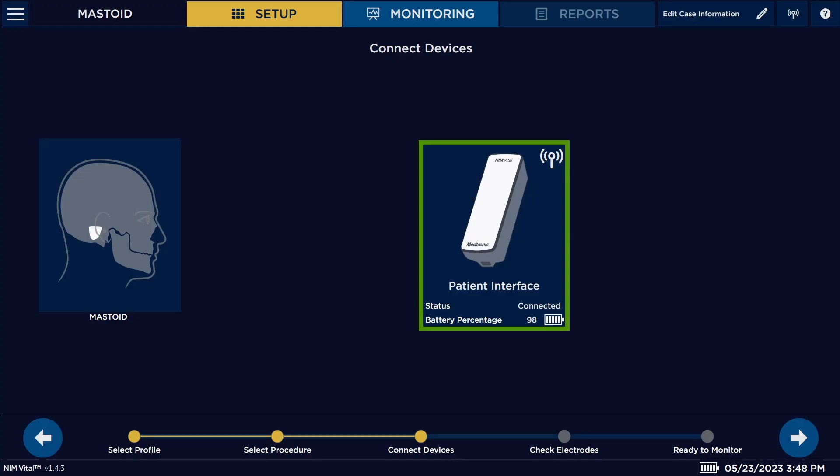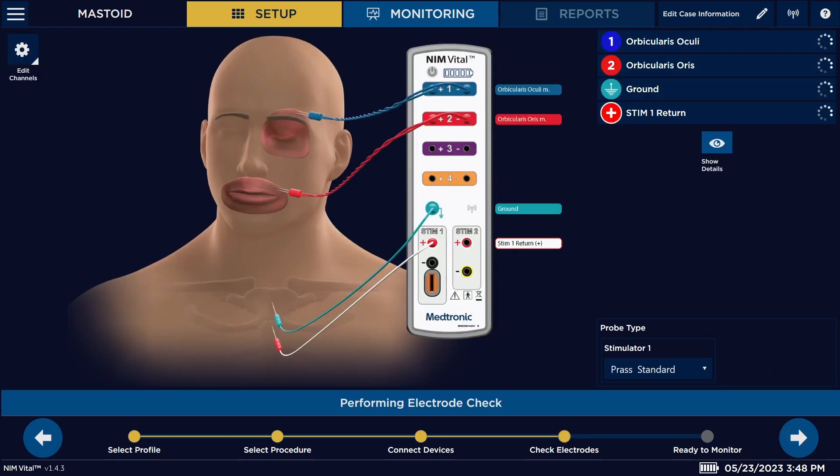Once we get to this screen here, we can proceed to the next screen using the arrow to the right. Now we're going to connect our electrodes, so we're going to bring the patient interface over to the patient.